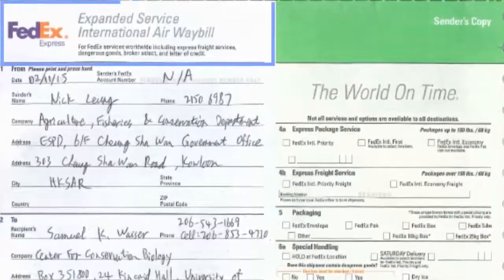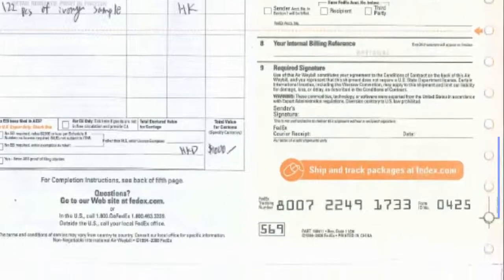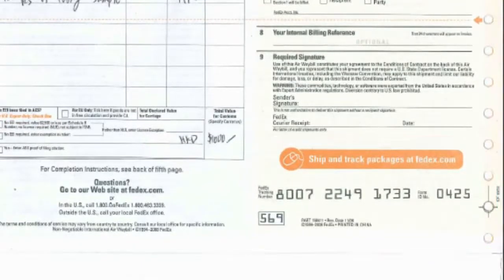Inform the laboratory via email of the name of the courier and the tracking number for follow-up as appropriate. Clearly label both the outside and inside of each box that holds the samples to guard against problems arising if the outer label is removed or damaged.